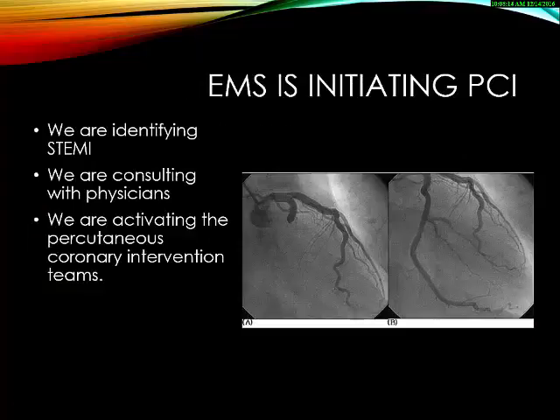If you have not had an opportunity to go to the cath lab, you are missing out. This is an amazing procedure that I've seen several times, and many of you have been able to go in with a STEMI and go up to the cath lab. But we are finding in the field 12 leads with STEMIs. We are initiating these cath labs from the field with our report and our 12 lead, and that's calling into action tens of thousands of dollars worth of staff that are going to come in here and perform these procedures, the percutaneous coronary intervention, where, as you know, they go right up into a blood vessel and open it up.